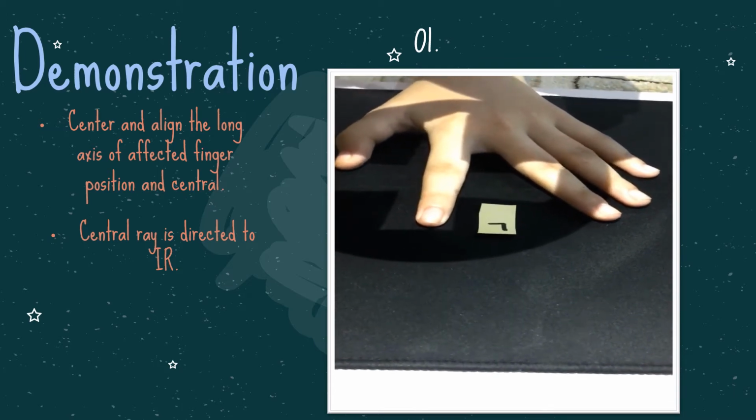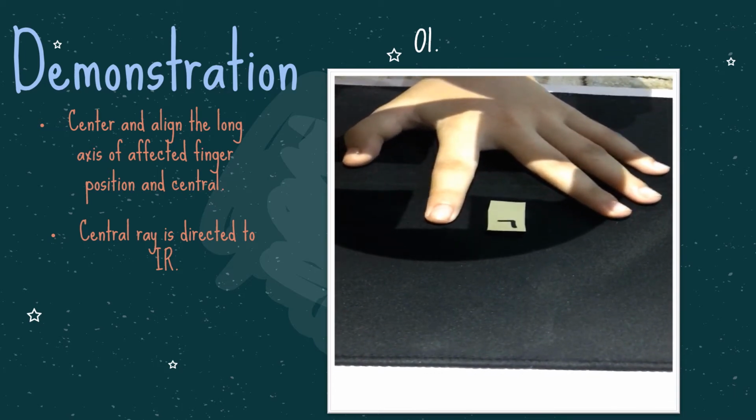To ensure no rotation of the digit being examined, the fingernail is centered over the distal phalanx. The concavity of the phalangeal shaft has an equal amount of soft tissue on both sides. The entire digit from fingertip to distal adjoining metacarpal is included in the radiograph. Bones are not overlapped, with open spaces at the interphalangeal joint and MCP joint spaces. Soft tissue and clear bony trabecular markings are seen.